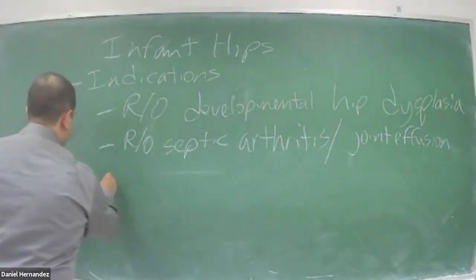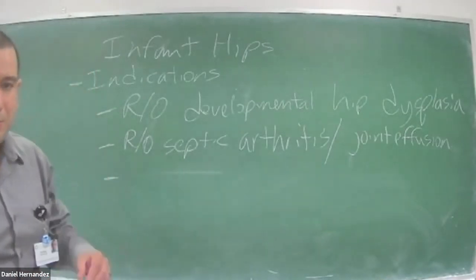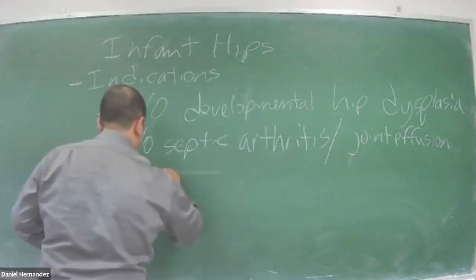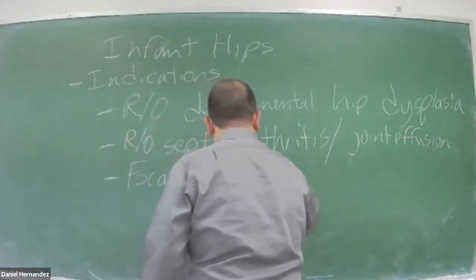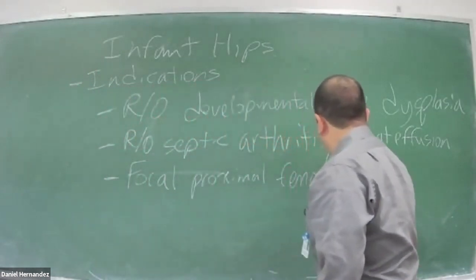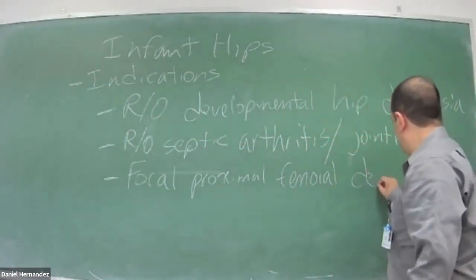Or we can also potentially be looking for a focal proximal femoral deficiency.